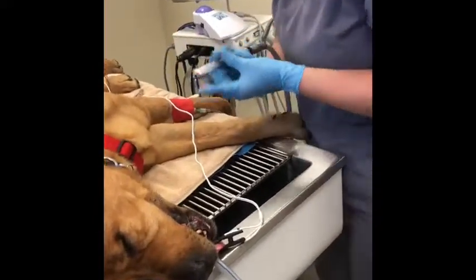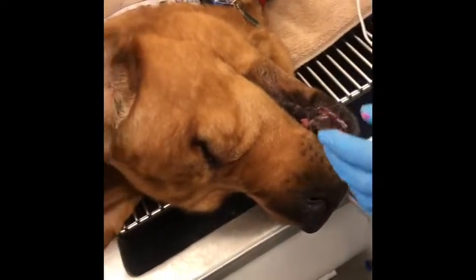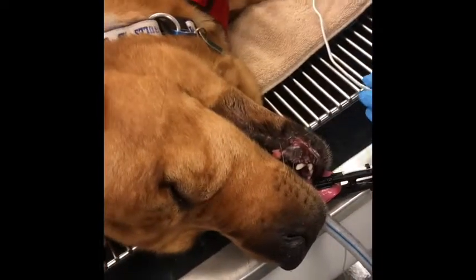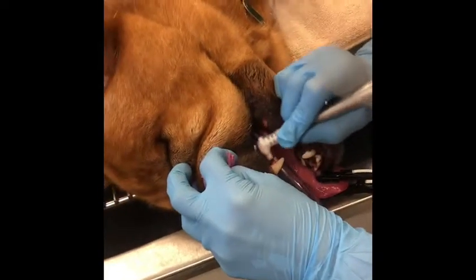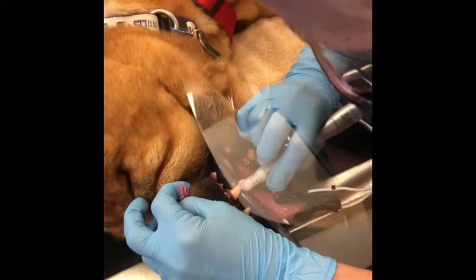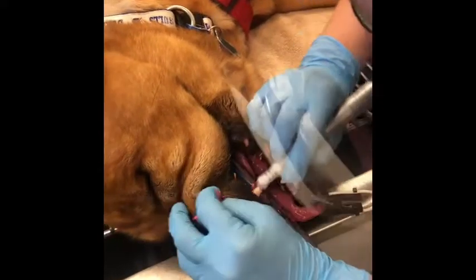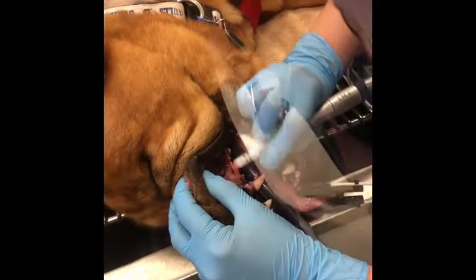We're now going to go ahead and polish the teeth. The major point about this is just like with the scaler — you do not want to stay in the same place for more than 10 seconds. We do want to make sure that we get all of the surfaces of the tooth that we have already touched with the scaler.